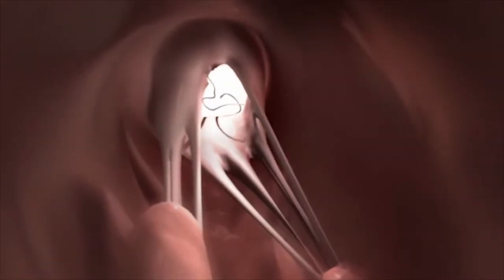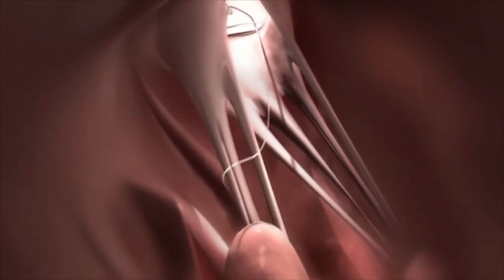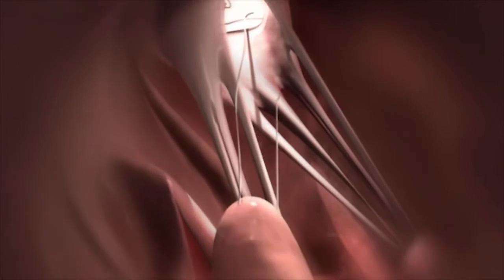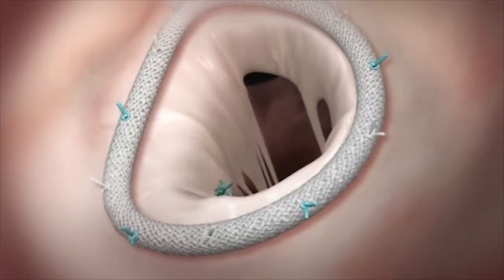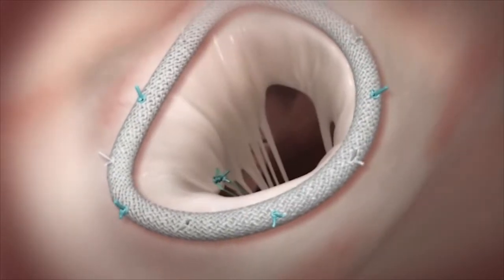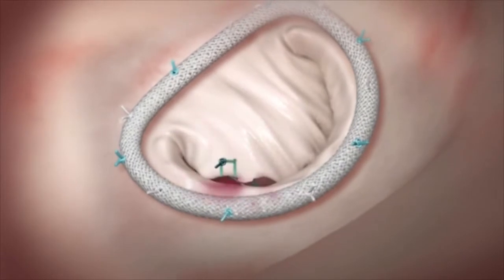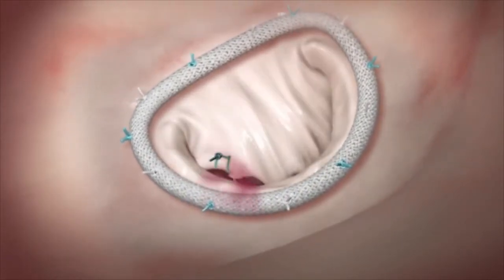Fixing a ruptured cord involves suturing the leaflet back to the papillary muscle during cardiac arrest, creating an artificial cord. However, after replacing the cord, the addition of an annuloplasty ring and resuscitation of the heart changes the anatomy. It is very difficult for the surgeon to exactly adjust the length of the new cord ahead of these changes — too long or too short, and the leaflet will not seal.